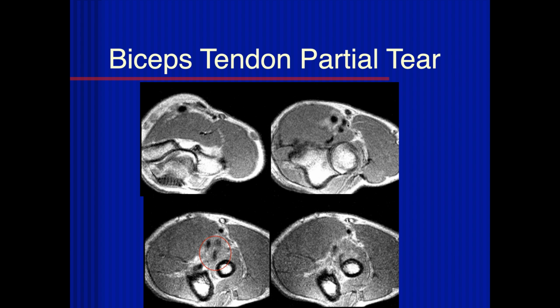Probably a little bit of hemorrhage and maybe chronic fibrosis around the tendon, and that's why the soft tissue planes are obscured here. You don't have normal fat around the tendon. This is just an example of a chronic partial tear, which we see here. These patients are symptomatic, and they're certainly at high risk of going on and tearing this. But if they have symptoms, sometimes surgery may be helpful even in these partial tears.